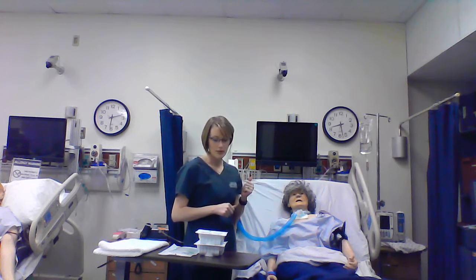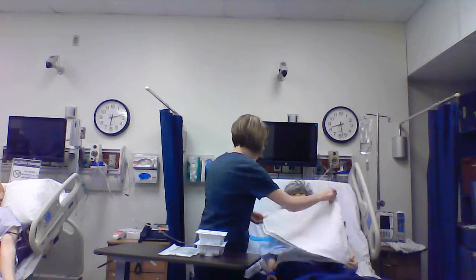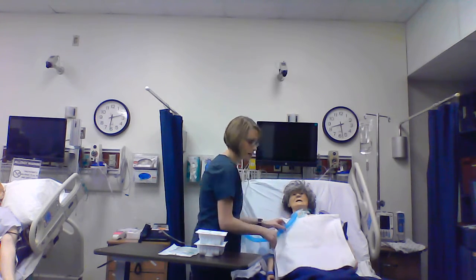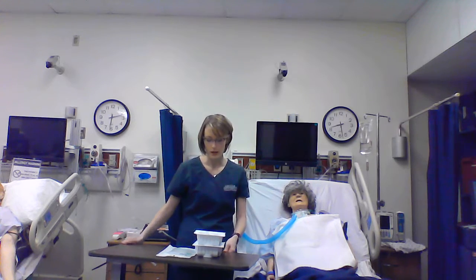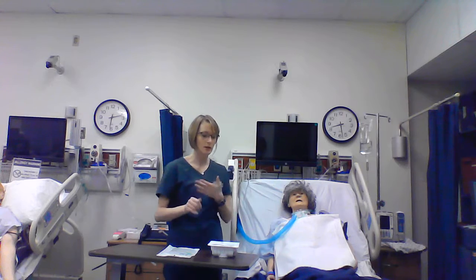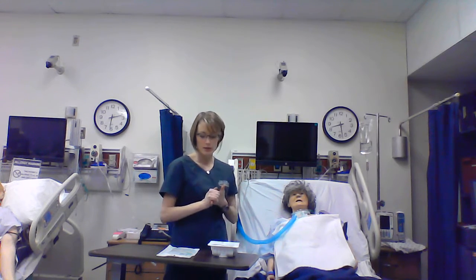So once I've established that with her, I like to drape my patients with a towel just to try to keep secretions off of their gown in bed. I would perform hand hygiene, so go ahead and wash my hands, foam in and foam out when you come in and out of the room. But I would wash my hands.